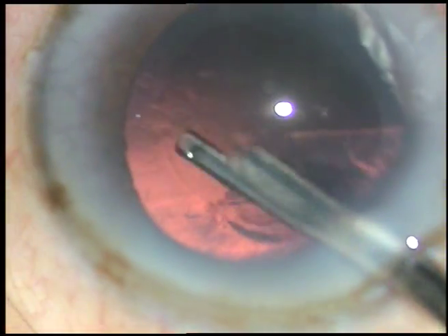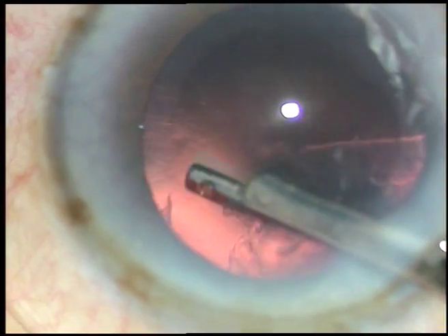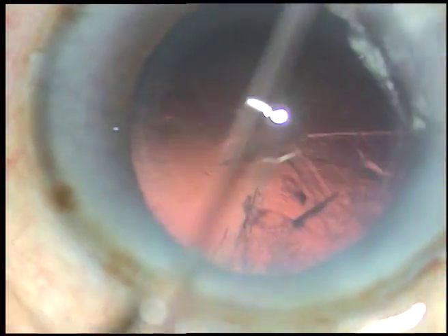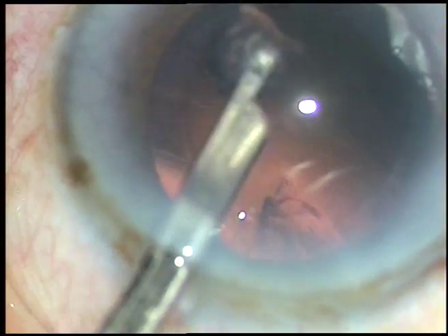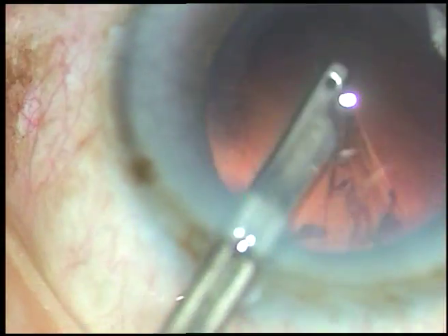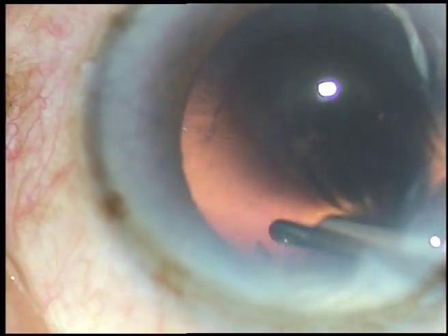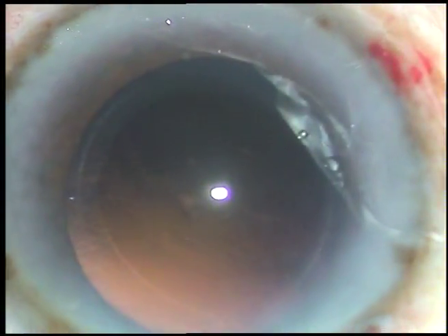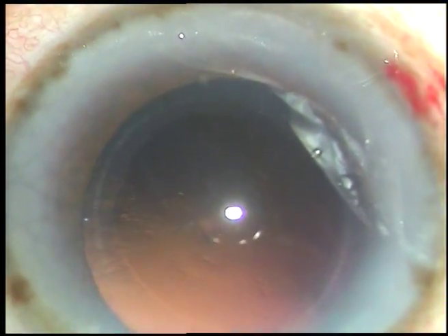This is a 23-gauge Simcoe cannula and I manage the cortex very well with this. It takes lesser time in my hands than bi-manual irrigation aspiration. This is the endpoint of cortical management and now intraocular lens implantation is to be done.